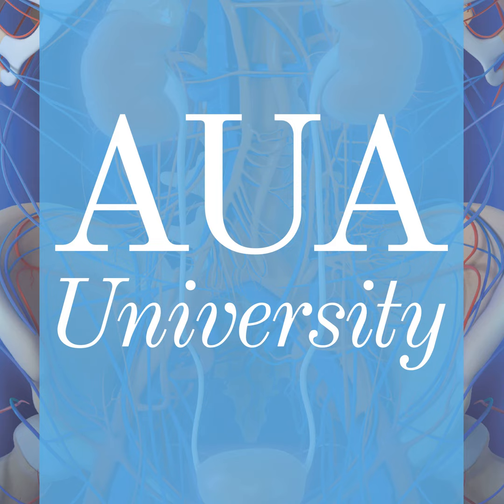And I put this in here because you can see, hopefully rightly, that over 50% of the time in this particular series, the management of the recurrent disease changed based on the PET scan. So we've seen disease management change in the initial staging as well as the recurrent staging. And I think that's also reflective now in our salvage prostate cancer guidelines from the AUA, SUO, and ASTRO.